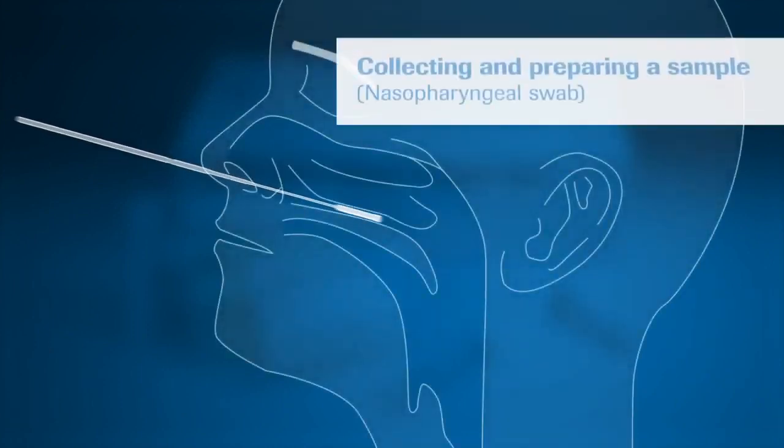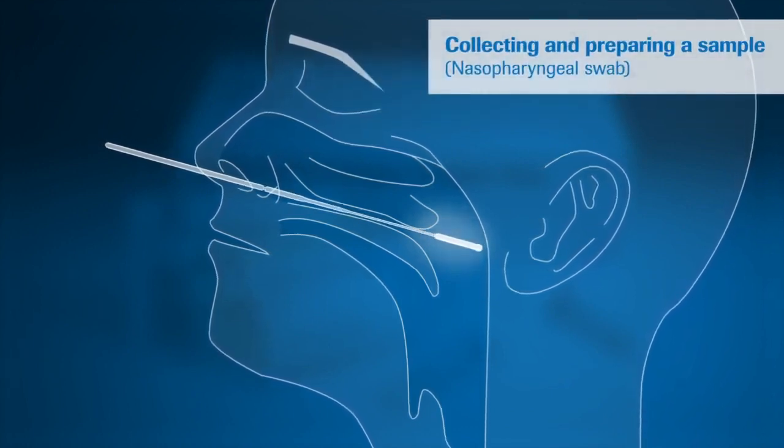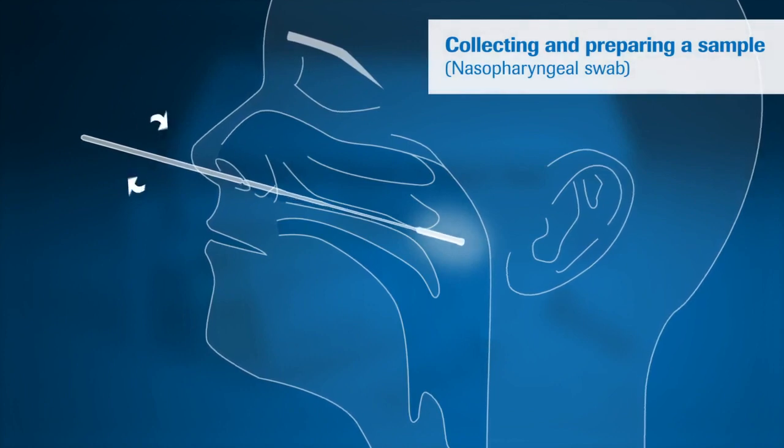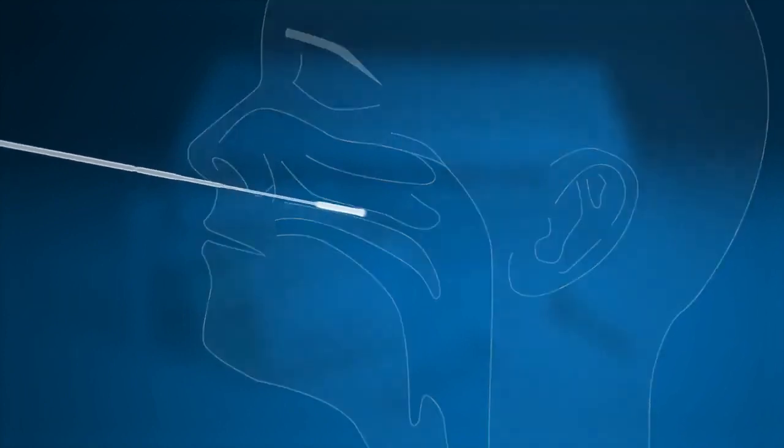When ready, insert a sterile swab into the patient's nostril and swab the surface of the posterior nasal pharynx. Rotate the swab three to four times and withdraw it from the nasal cavity.